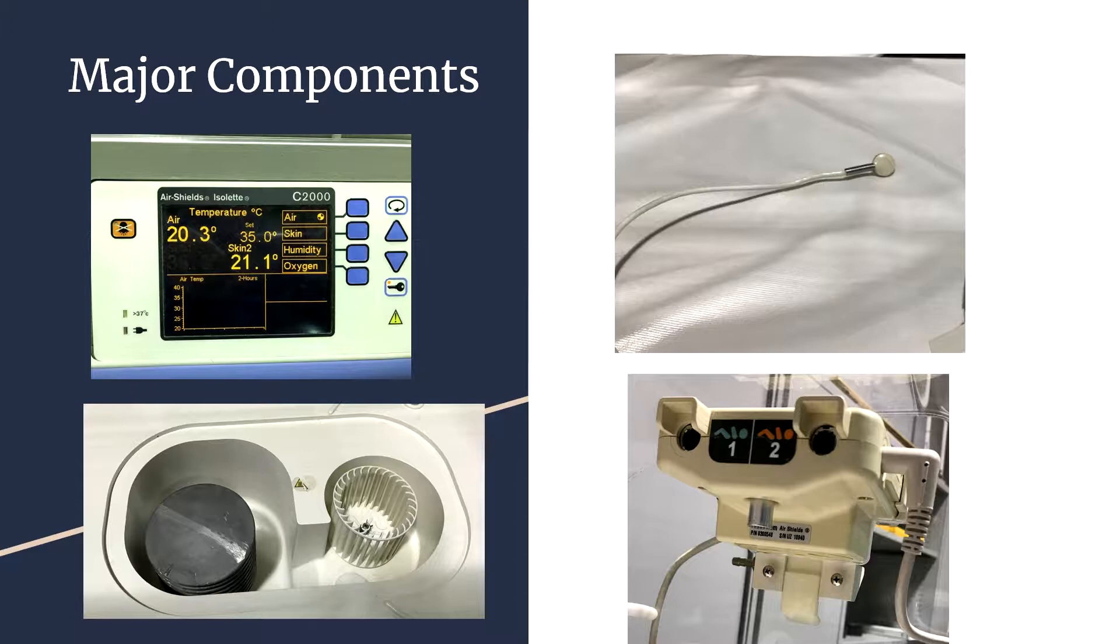Here are the major components. On the top left is the front screen. Most of the operations can be done through this. It displays information on air temperature, skin temperature, humidity, and oxygen content inside the infant incubator. You can also adjust the temperature and humidity according to your needs.